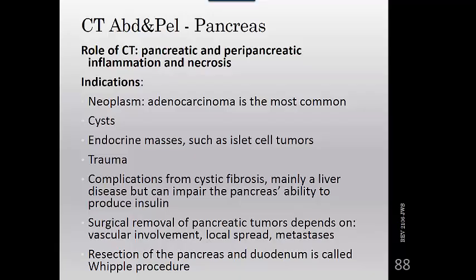In a jaundice patient, non-contrast scans through that area of the common bile duct might allow you to visualize common bile duct stones or calculi. Water or a low attenuation oral contrast is preferred because dense contrast can obscure those small stones. So if that's what you're looking for, you want to choose a low attenuation oral contrast.